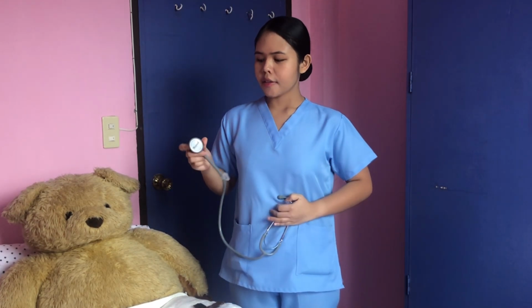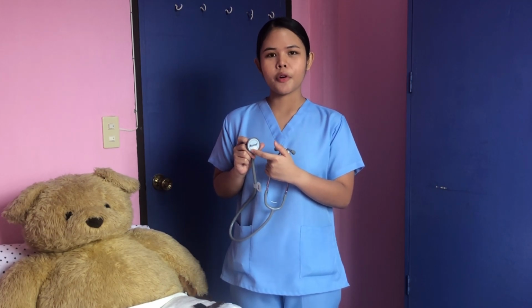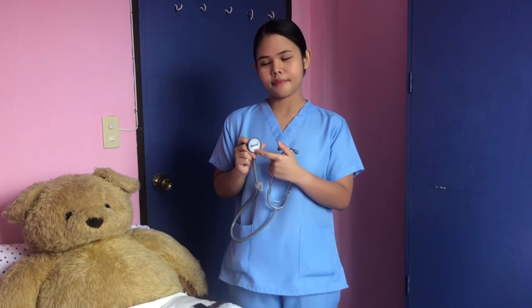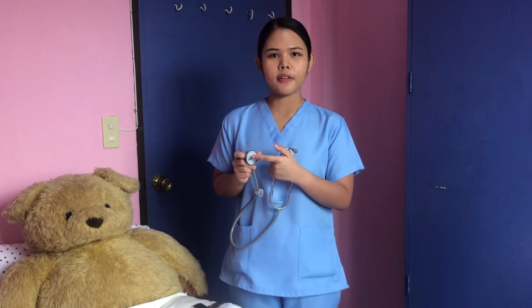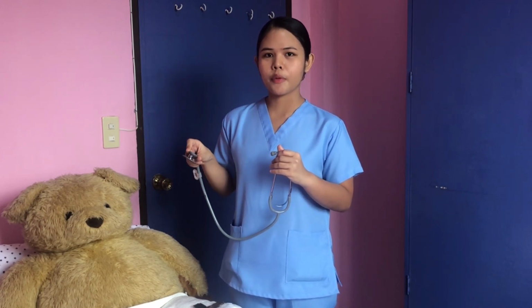Auscultate lung sounds using the diaphragm of the stethoscope directly over the skin of the designated auscultation areas, to listen for lung sounds and any abnormal or adventitious lung sounds. So it is important to listen for the full cycle of respiration, both the inhalation and exhalation, to fully determine if there are normal or adventitious lung sounds. Then also tell the patient to deep breathe through the mouth so that the lungs will expand and you can listen for lung sounds very well.